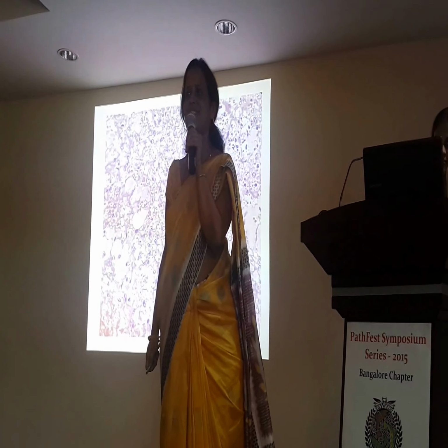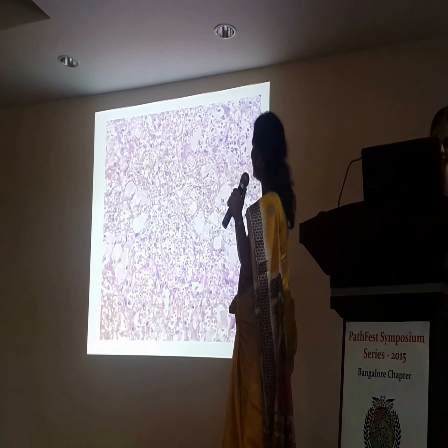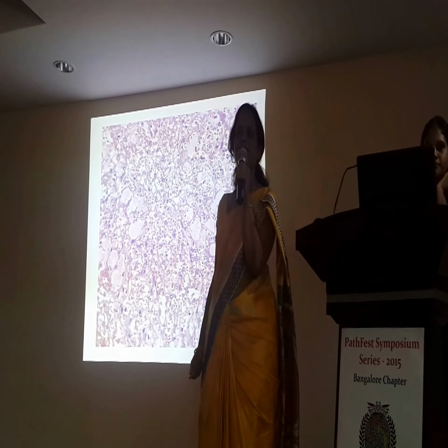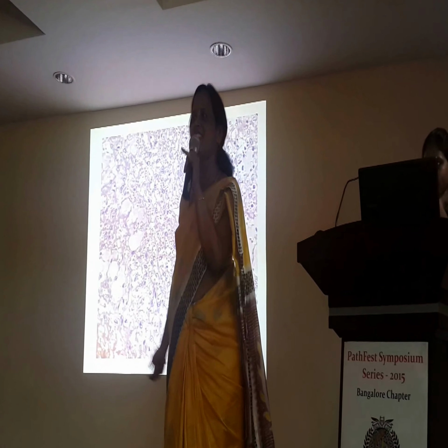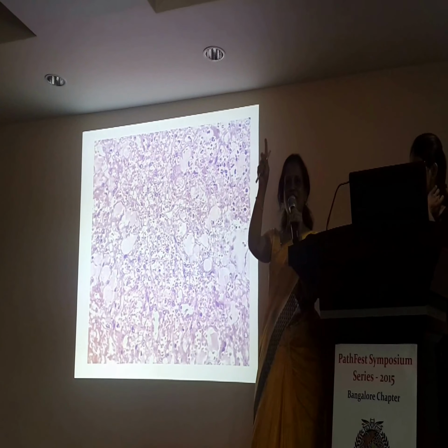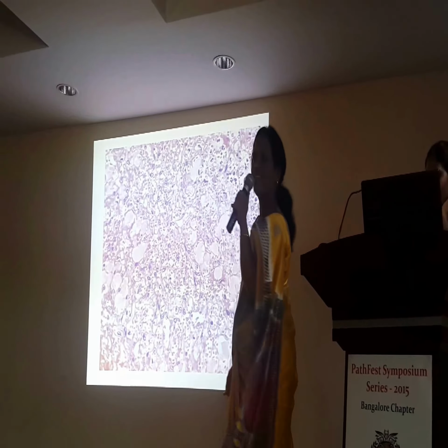Vascular channels? Sinusoids, okay? How are they? Happy? Bloated? They're congested. Yeah. I've given you a terminology, and I think you need to get the organ next.